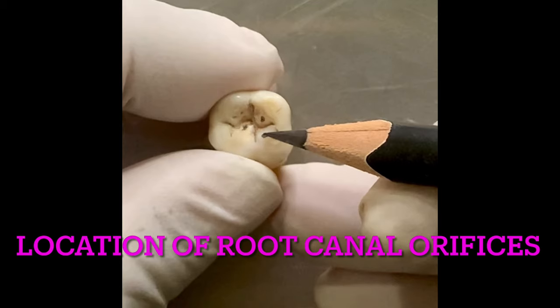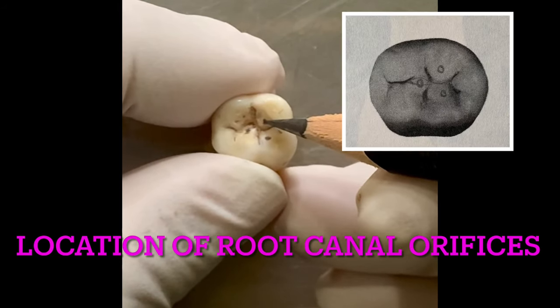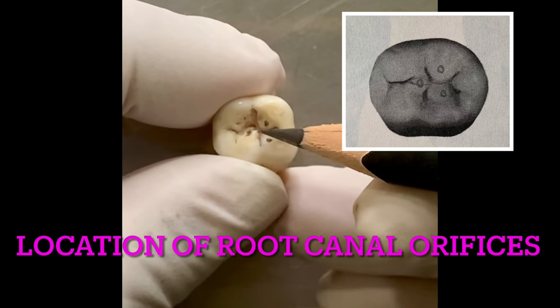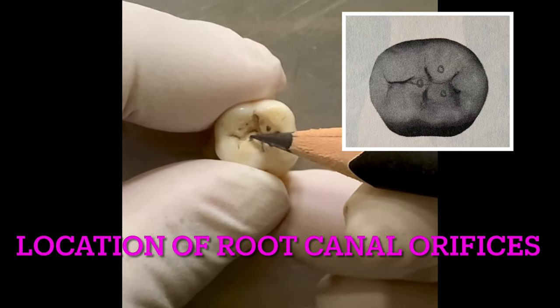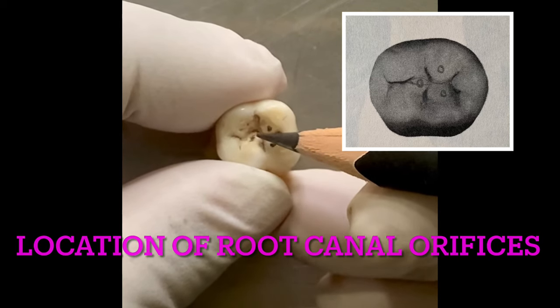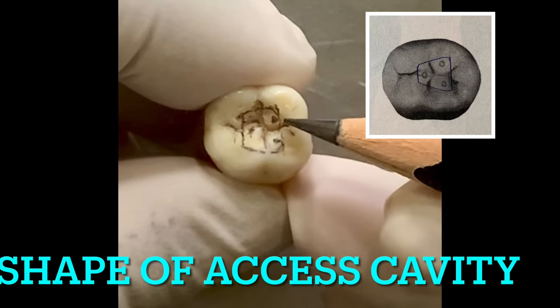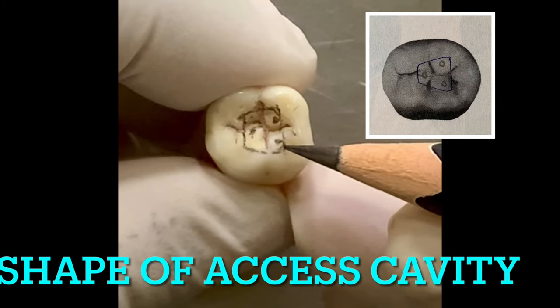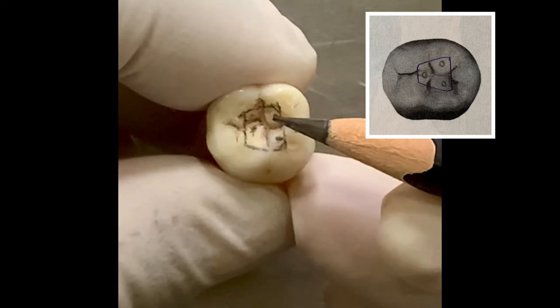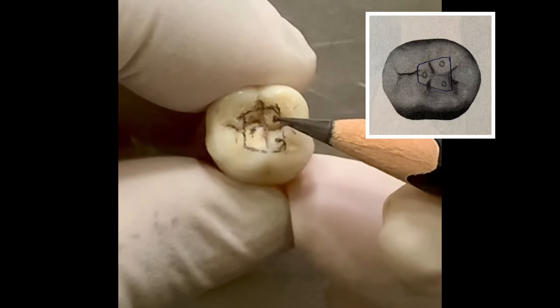Three root canal orifices are expected to be found: the mesiobuccal orifice, present under the mesiobuccal cusp tip; the mesiolingual orifice, under the mesiolingual cusp tip; and the distal orifice, present slightly distal to the central pit. The shape of the access cavity is trapezoid — wider on the mesial side, less wide on the distal side — with three root canal orifices.